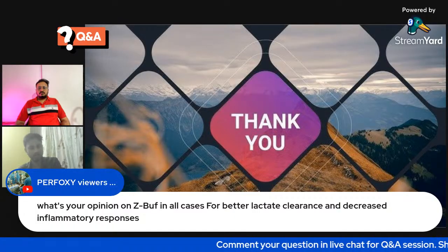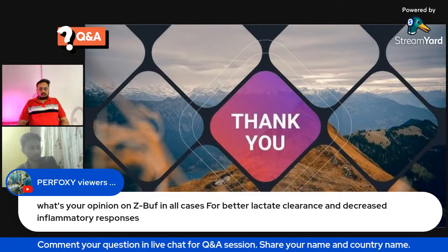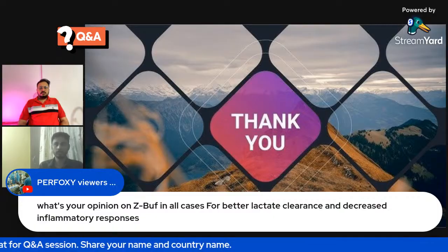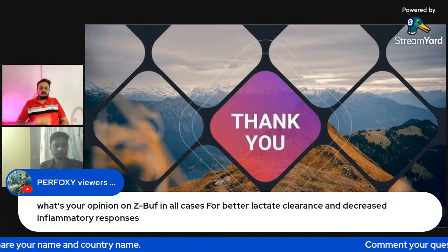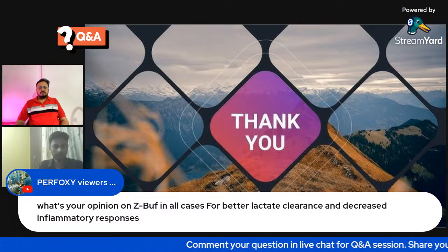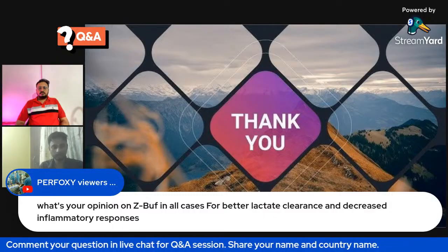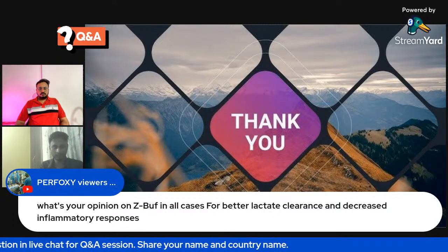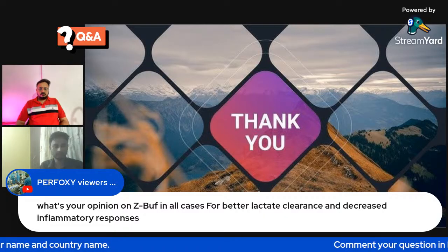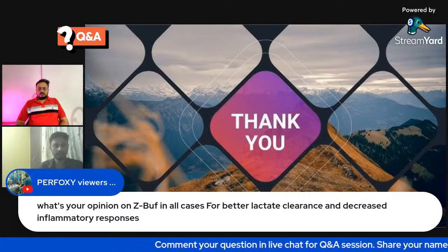And during the rewarming period, the inflammatory mediators start peaking and are very high, and that time ZBUF is useful. And one more thing, pre-bypass ZBUF means we are adding PC and FFP to the pump, to the circuit. So that time some inflammatory mediators are there, and using ZBUF is useful. It will remove hyperkalemia also. In that condition ZBUF is very useful, sir.